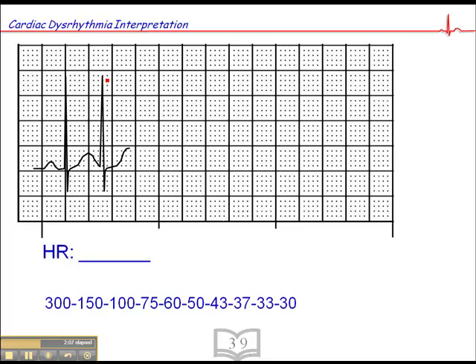This next one — the second QRS complex doesn't fall on a dark line, so that complicates things a little bit. Here's an easy method: find a QRS on a dark line and count 300, 150. So the heart rate is somewhere between 300 and 150. The difference between 300 and 150 is 150, divided into five small squares — that's 30 beats per small square. So the heart rate is 150, 180, 210.